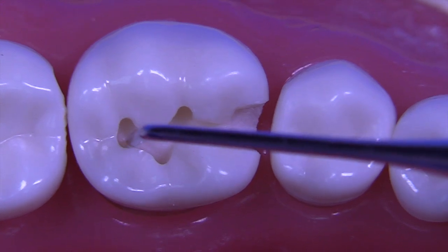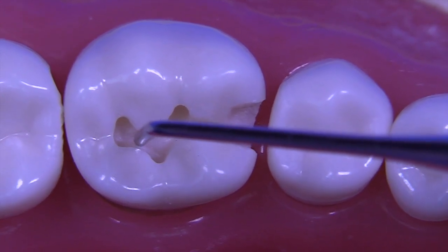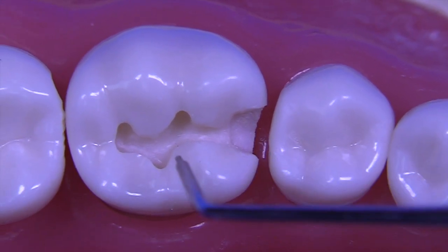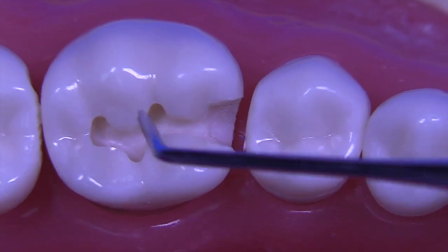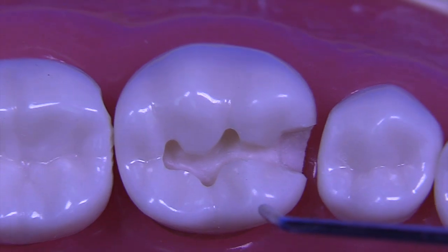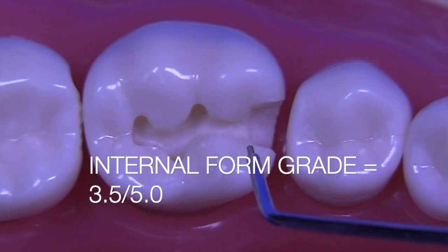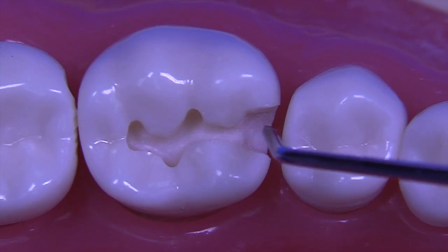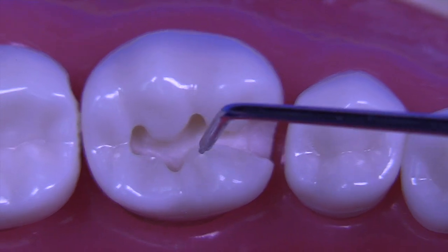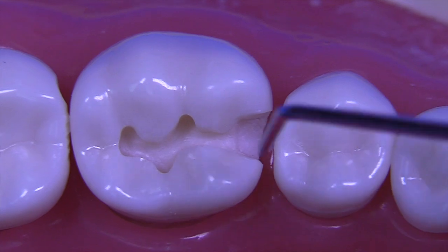There's a little bit of a line across here. You can see that right there. So maybe that would be a little bit of a bump right along that area. But otherwise, it looks pretty good. And I don't think that there's much more I want to say about that other than I would probably give this grade on the internal a 3.5 out of 5.0 because of the issue with the axial depth and the convergence divergence error. In other words, not having your handpiece burr perpendicular to the occlusal table.